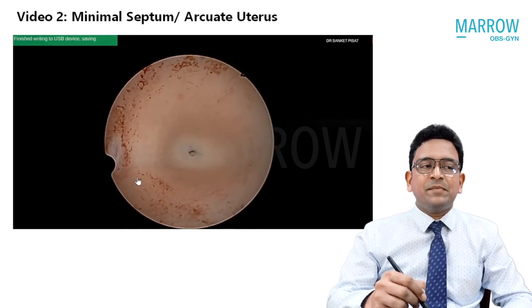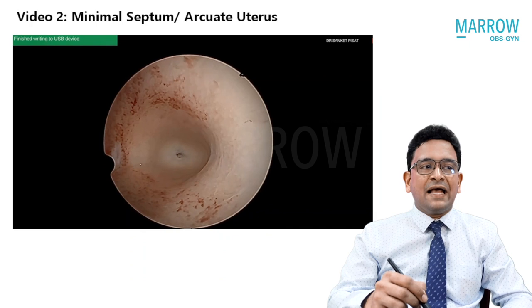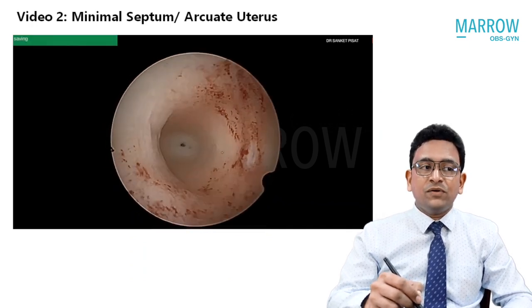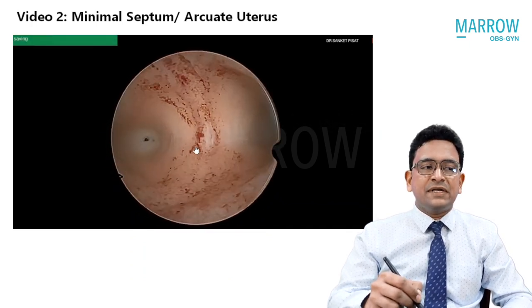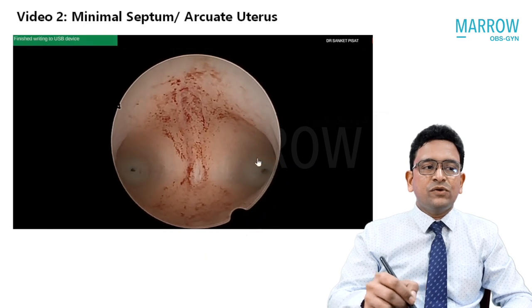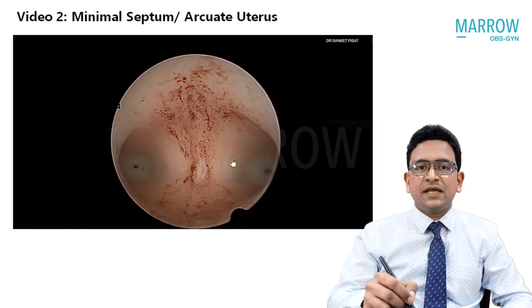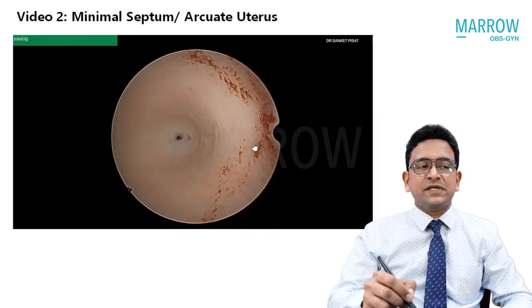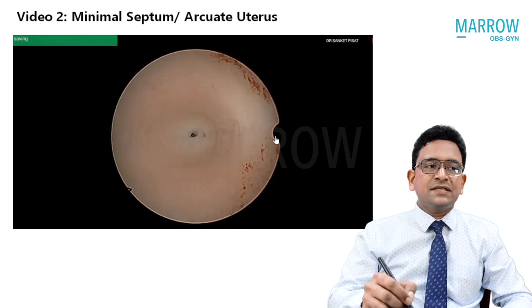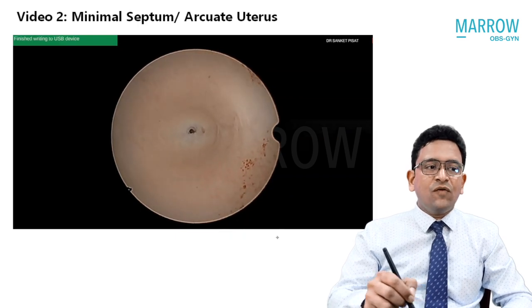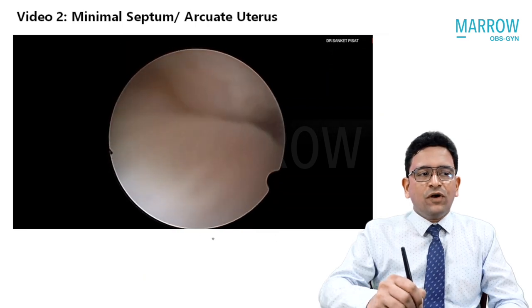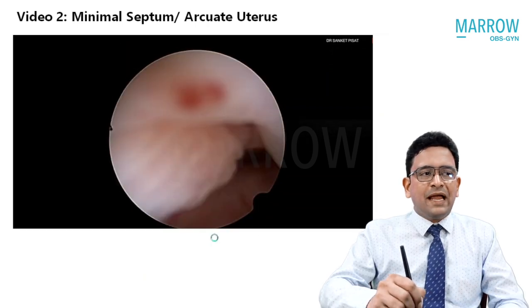There is a definite demarcation — an inward indentation of the fundus of the uterus — and this can be classified as a septate uterus, though the amount of septum is minimal. The two tubal ostia can be clearly seen on both sides in this picture. So this is a septate uterus.